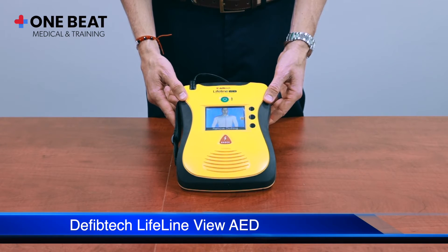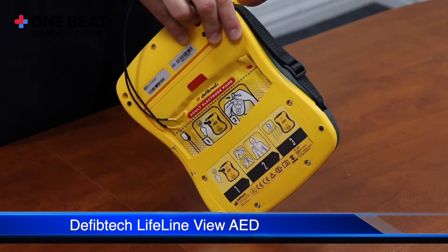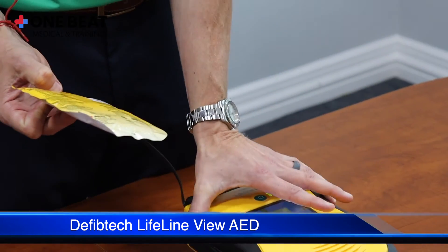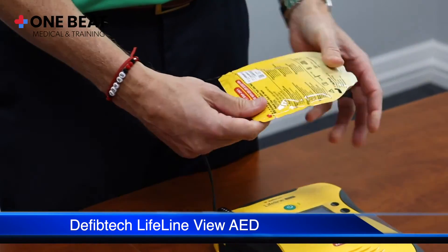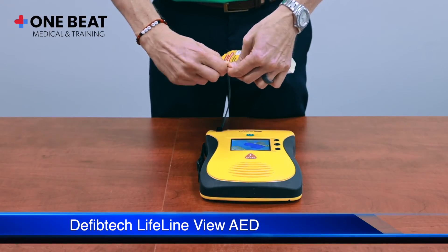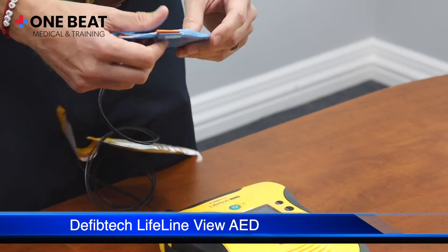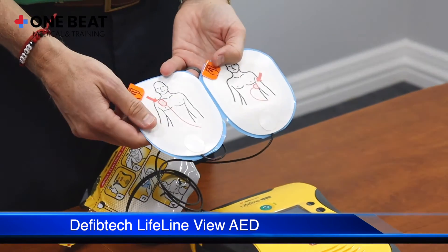Remove clothing from patient's chest. Locate the pads package in the back of the AED. Tear open pads package. Peel adhesive pads from blue liner. Apply pads to patient's bare chest as shown.